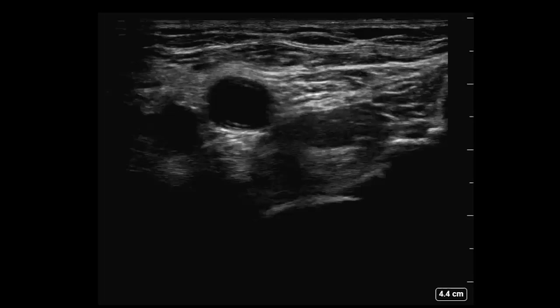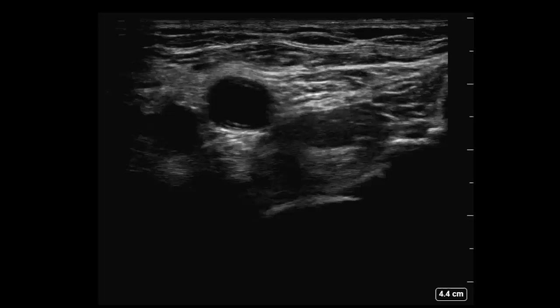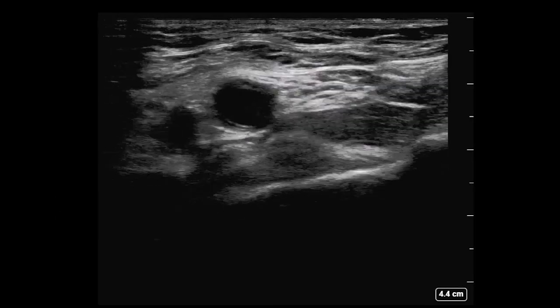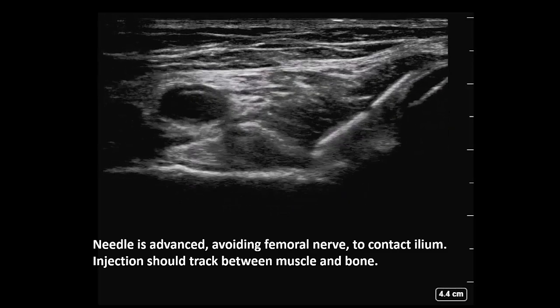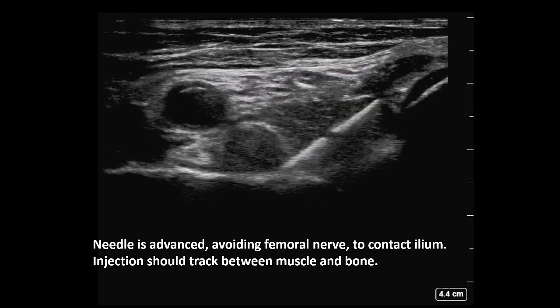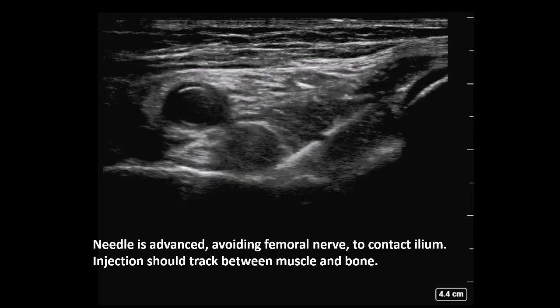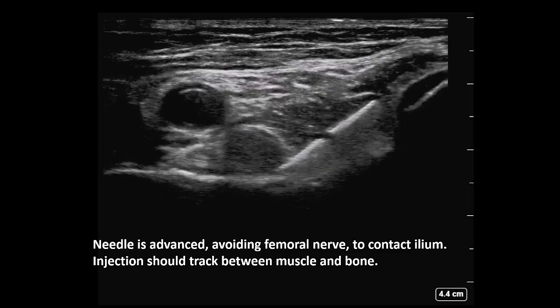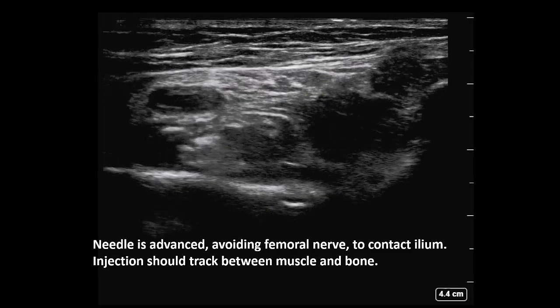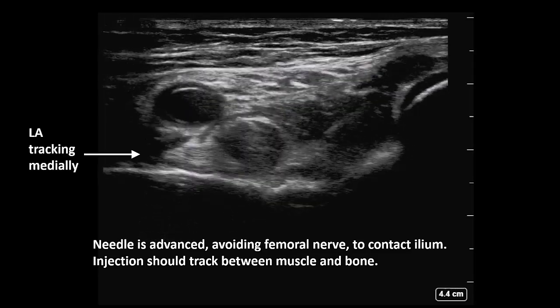This video illustrates the block using a linear probe. The probe is placed over the femoral artery in the oblique orientation described earlier. The femoral nerve is visible lateral to it, and deep to that, the line of the femoral head. The probe is slid cranially to lie over the iliopubic ramus. The needle is then advanced from lateral to medial to contact the bony surface of the iliopubic ramus. Injection in the correct plane lifts the muscle off the bone, and as local anesthetic is injected, it should start to track medially.